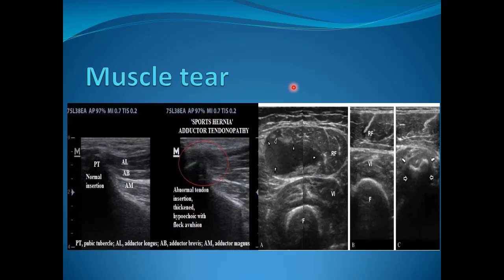Muscle tears are one of the most common pathologies, particularly in athletes. This is an example of the rectus femoris muscle showing an intersubstance partial thickness tear causing a hematoma. Another example shows a calcific lesion within the vastus intermedius muscle compared to the normal side, denoting an old calcific insult.